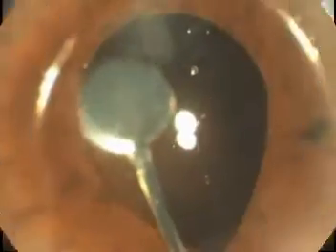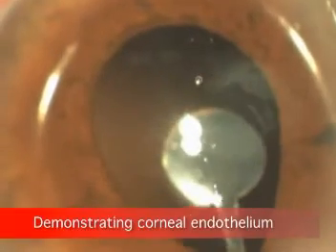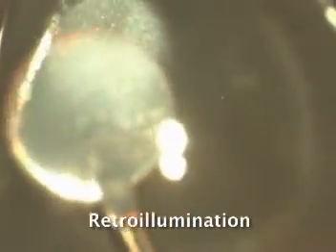During the clinical trial of the intraocular mirror, the ophthalmologist who designed the mirror identified a noteworthy finding. When looking at the surface of the mirror and looking at the retroilluminated area of the cornea, he realized that the endothelial surface is visualized with the mirror by way of either reflection in the mirror or retroillumination.